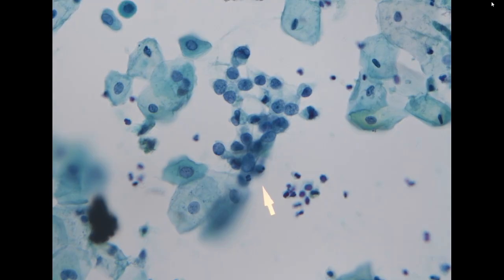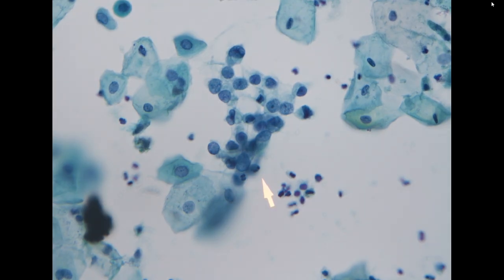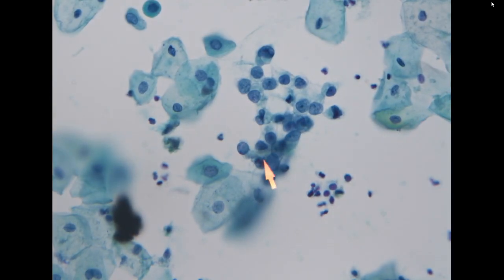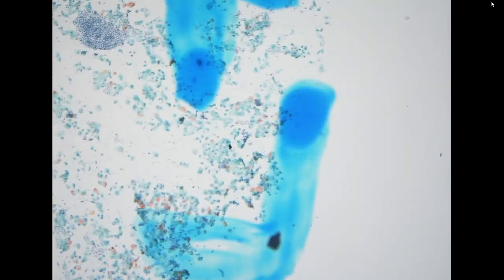The patient indeed has a past history of high-grade urothelial carcinoma, but it's in the renal pelvis. It's upper tract. It's not in the bladder. So sometimes in upper tract lesions, the shedding cells could be scant, which can look like this, with more normal cells but scant atypical cells. So indeed, I think in this preparation, the criteria do not fit for a definite diagnosis of high-grade urothelial carcinoma. So we call this specimen atypical.